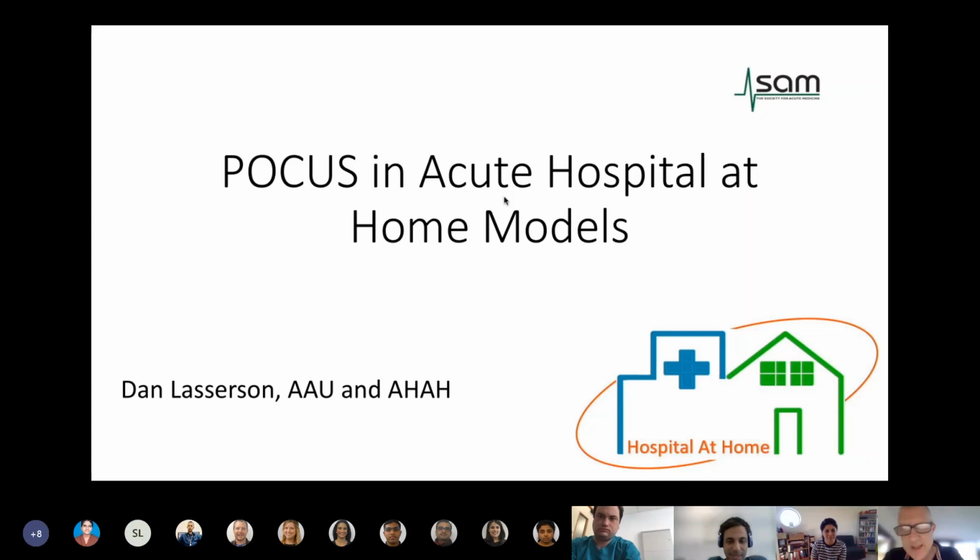So this is only case number one, but we hope it's one of many, and we can reflect on how this helped. But certainly for me, I felt much more comfortable managing what could be a very complex medical situation of pretty severe sharp AKI with clinical impact in somebody with a pretty low ejection fraction who is so fragile, they need to be under a hospital at home heart failure team. A nice example of how a pluripotential view on POCUS, there are a number of organs you want to be doing in a sweep if you're managing care in this setting.